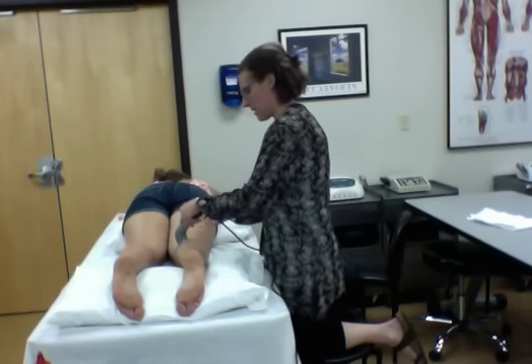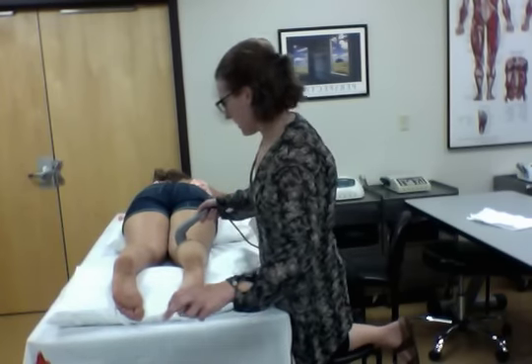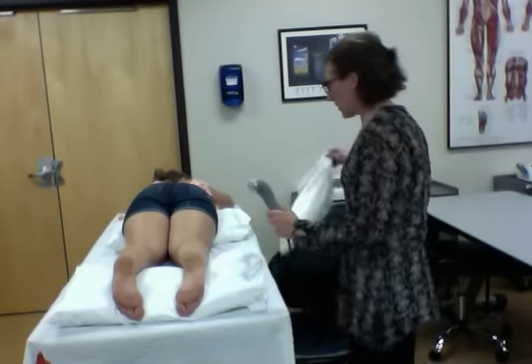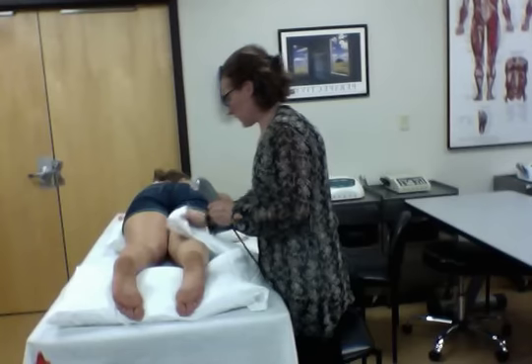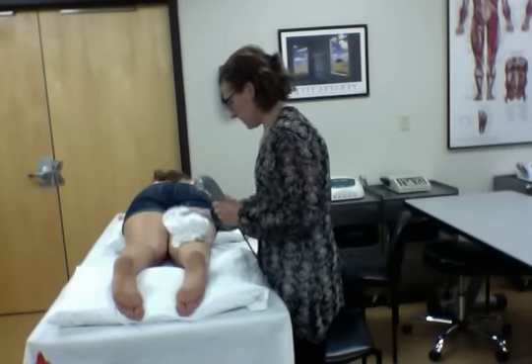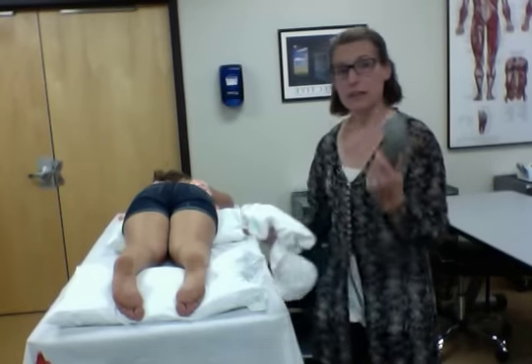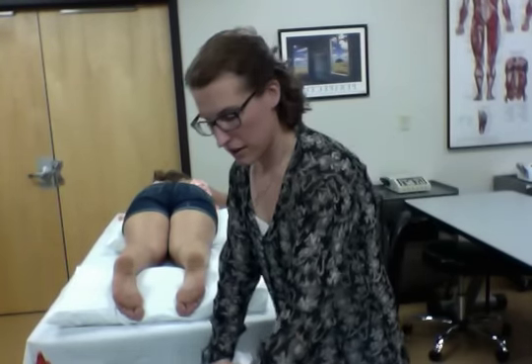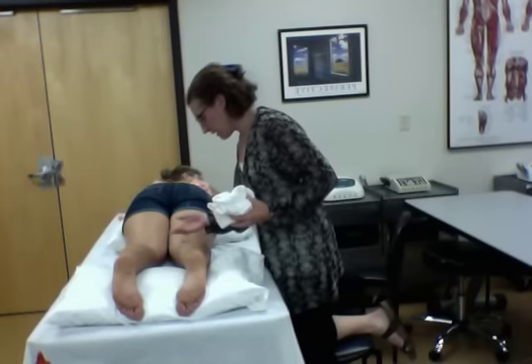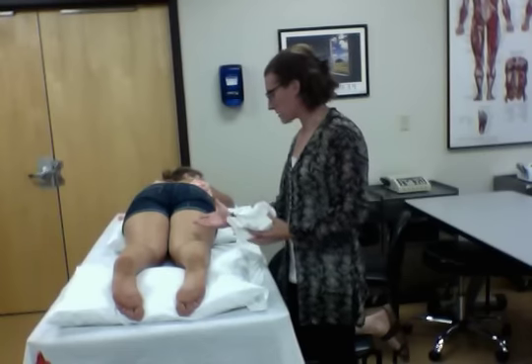Alright, so let's say we came to the end of our treatment time here. It beeped at me because we were done. And again, I'll take a towel. And on the ultrasound head, I would clean the ultrasound head with some rubbing alcohol. I'm going to go ahead and inspect your skin. It is not warm, it's not red, it looks perfectly normal, so that's great.